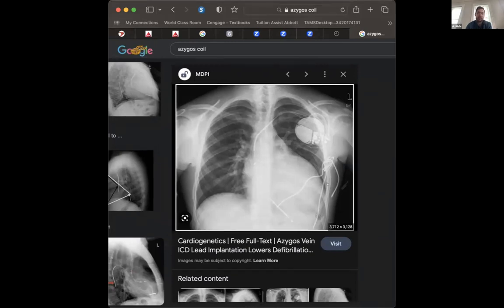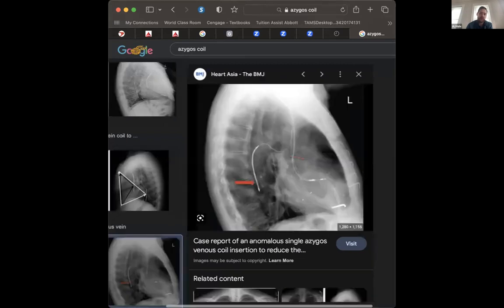When we talked about earlier, you were talking about putting patches and paddles on, getting the proper vector. It's something to consider as well for internal defibrillators. If you have a massive heart, then one RV coil, this vector may not be enough to engage enough tissue. So that's why they may try to bring in an azygos coil that gives you a more posterior aspect here, so you can engage all the tissue from the RV to the more posterior vector there.